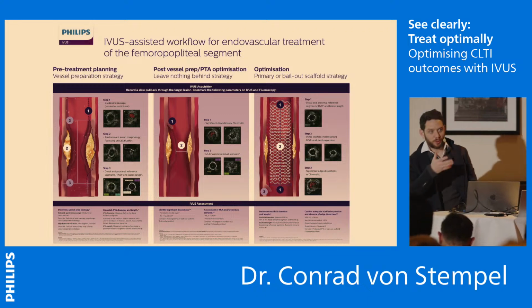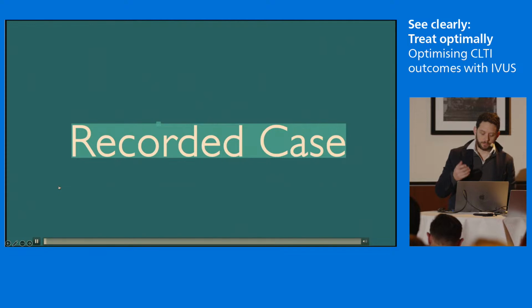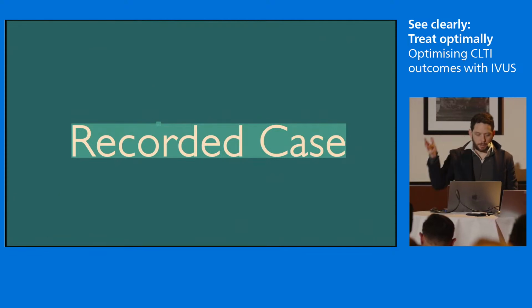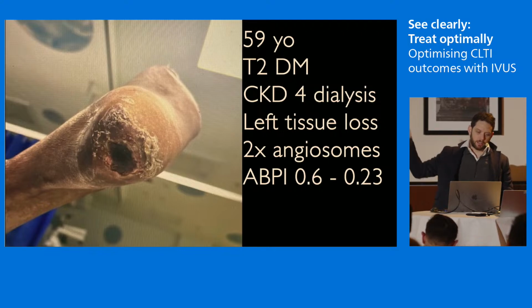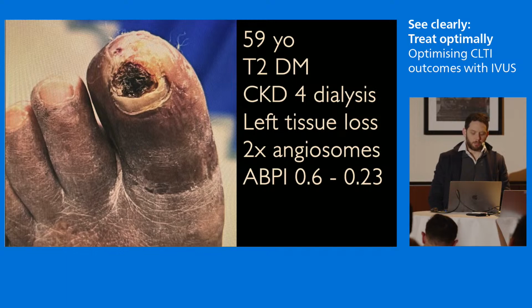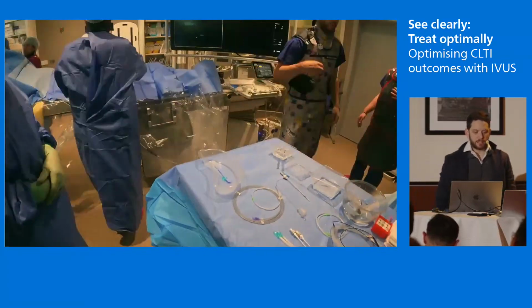I'm also going to show a sort of quiz, but I'm going to start off with a case. This is a case I performed with Shankar Benogama here at UCLH about 2 years ago now. It's a video, so we'll play it through and I'll stop it. It's cut and pasted just to show what's going on in this diabetic chap who has pretty severe disease, dialysis dependent, lots of ischemic heart disease, older than his years.